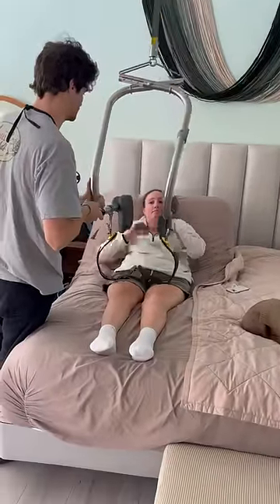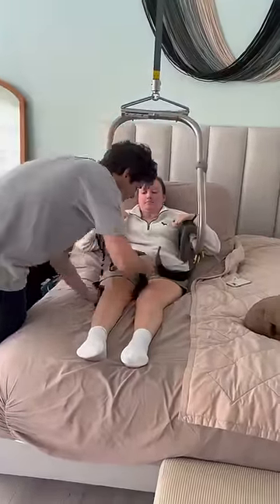Hi guys, I wanted to show you my Sure Hands lift that I have in my bedroom, and this is me getting out of bed.